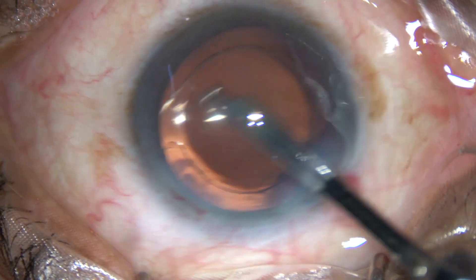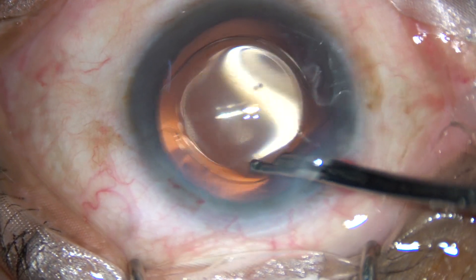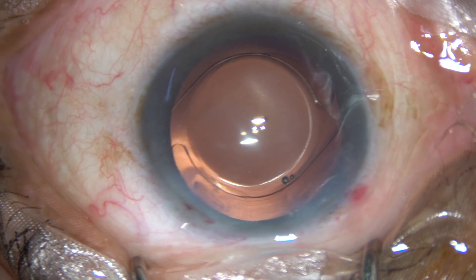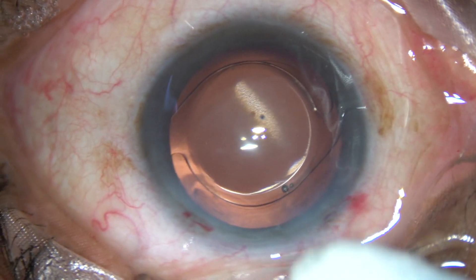The case is done after formation of the anterior chamber. Thank you very much. Hope this video will help you in developing your surgical skills. Don't forget to check the integrity of the wound.